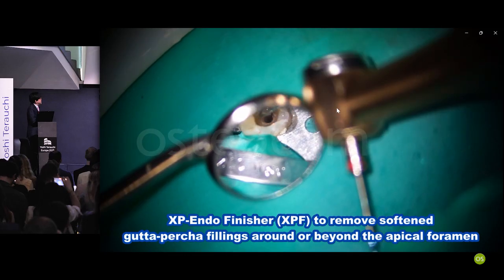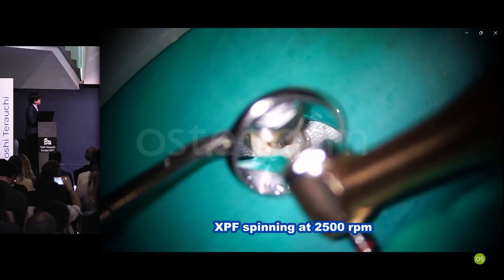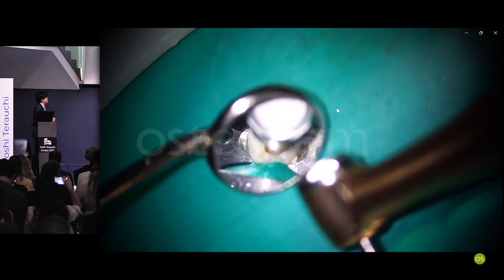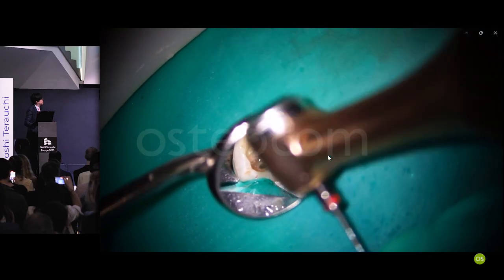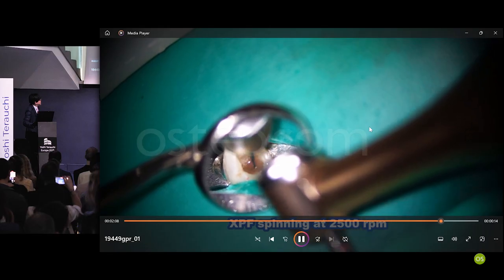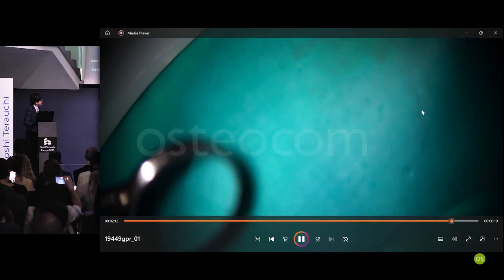So I finished with a XP finisher to make sure there's no more gutta percha remaining on the root canal walls. I spin it with chloroform inside. I even extruded the instrument beyond the apical foramen. So that's why you see the blood coming out. Then I take a look, and I take radiograph and take a look.